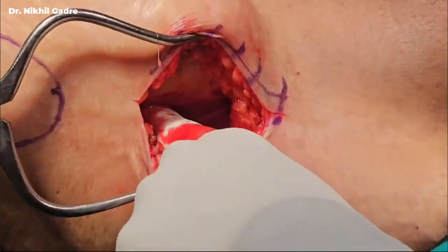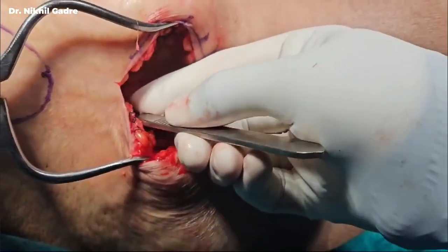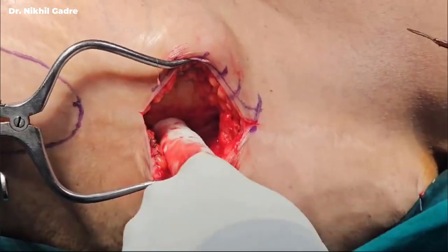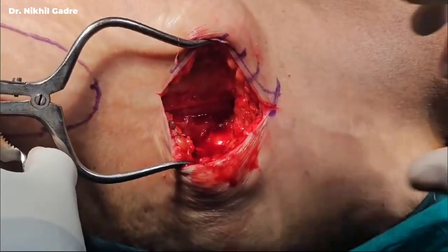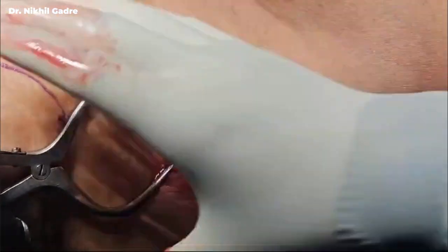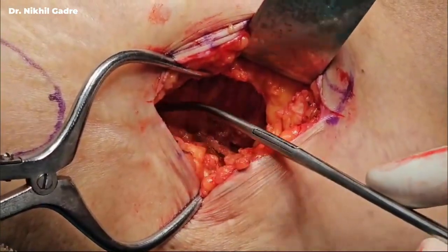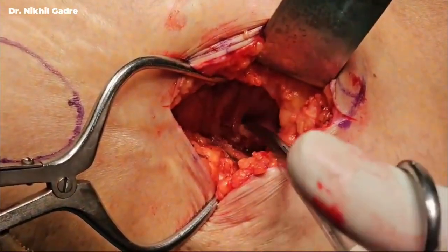Now we have just opened the TFL. We don't need to make a very huge incision. It should be small. Now we'll reposition our self-retaining retractor deep to the TFL. As you can see, we have divided the fascial layer. These are the gluteal muscles.